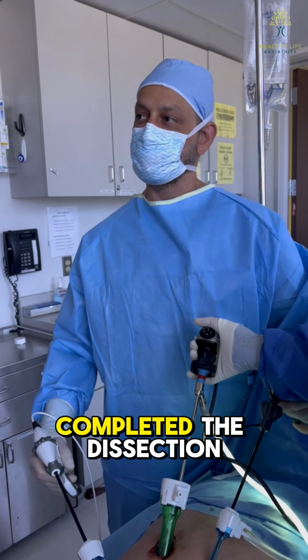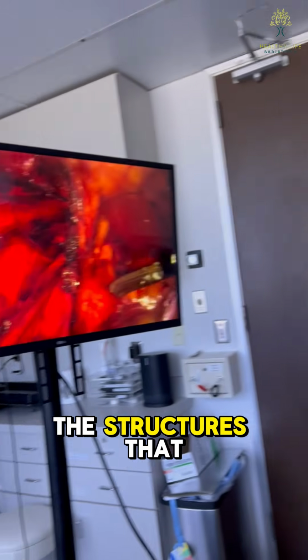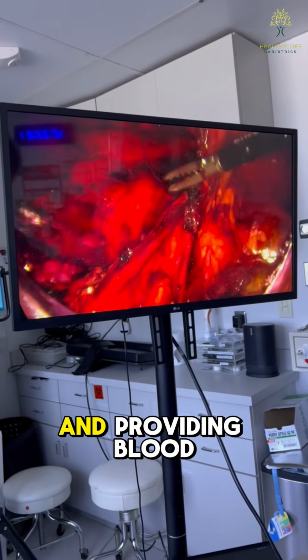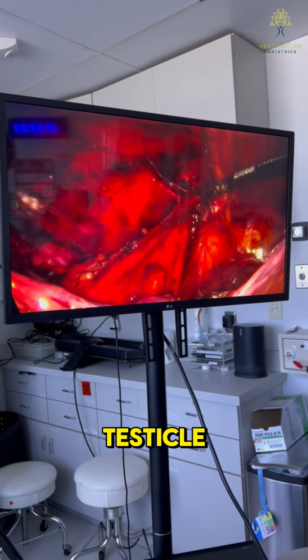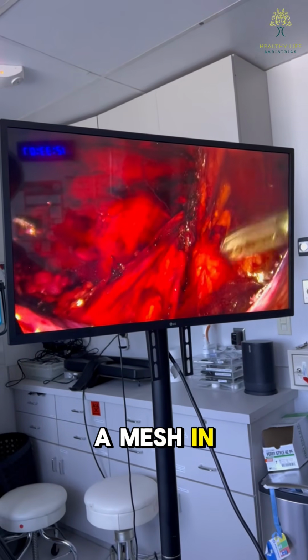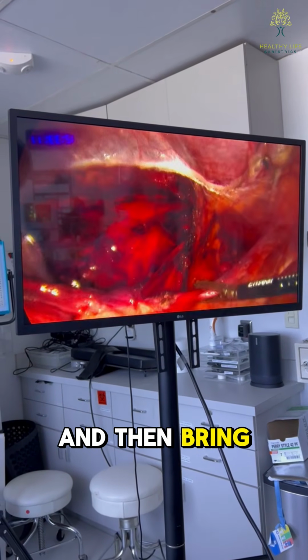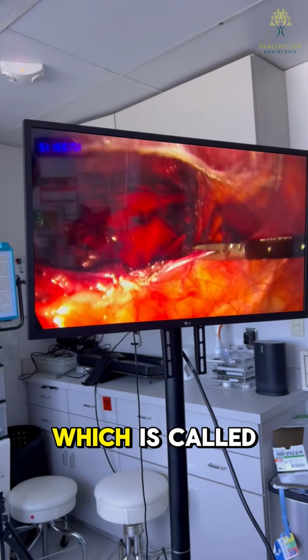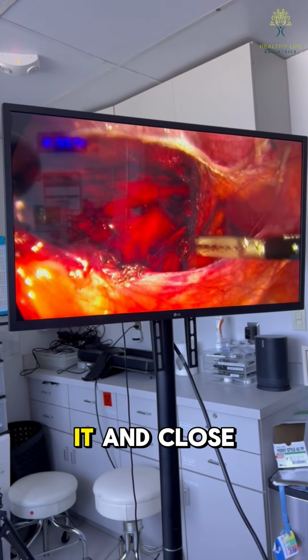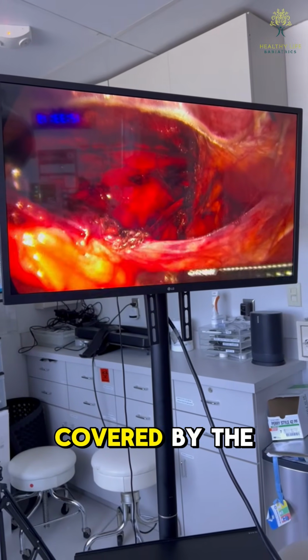So we have completed the dissection of the floor of the pelvis. Now you can see the structures that are really important in providing blood supply to the testicle. What we're going to do is put a mesh in this whole general area and cover it, and then bring this nice structure, which is called the peritoneum, on top of it and close this area so the mesh will be covered by the peritoneum.